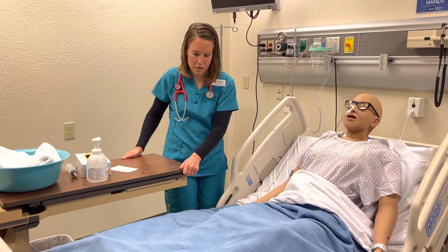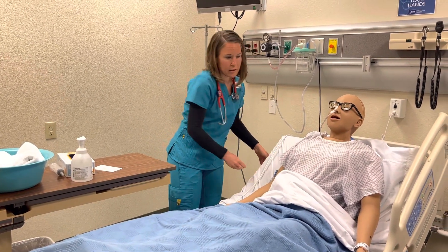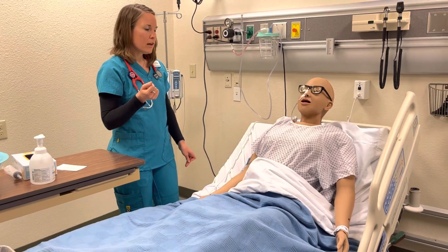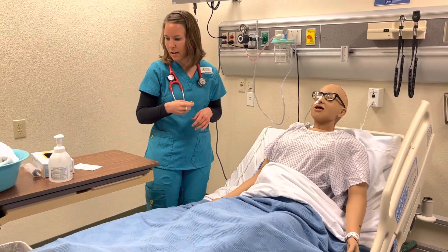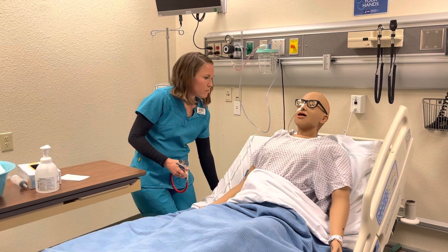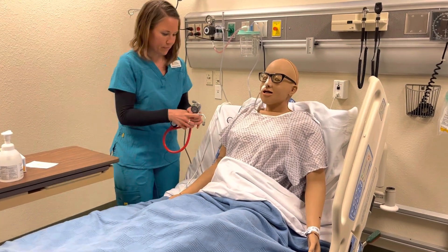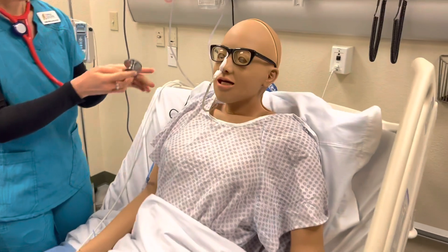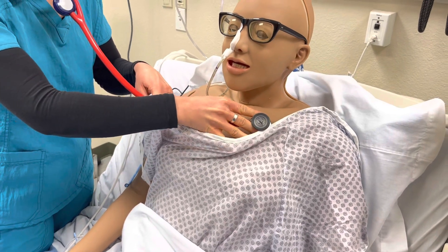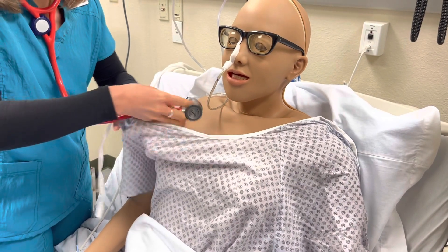We have an order from your doctor to take out that nasogastric tube — that tube that's in your nose — so I'll walk you through the steps as we go along. But first of all, I'm going to listen to your lungs and your bowel sounds. I'm just going to raise you up to a high Fowler's first. I do have that door closed there for you too, with the curtain, just so we're providing that privacy for you.